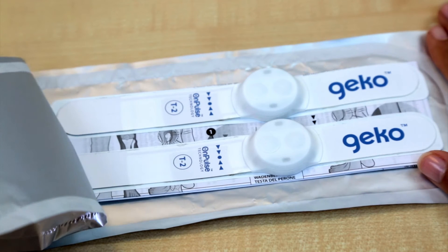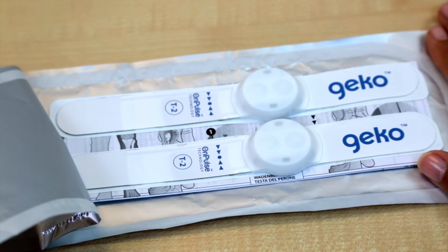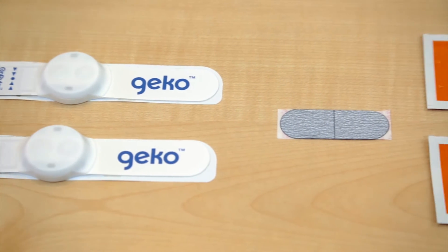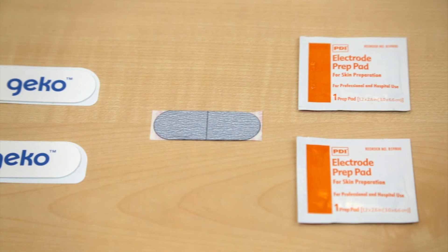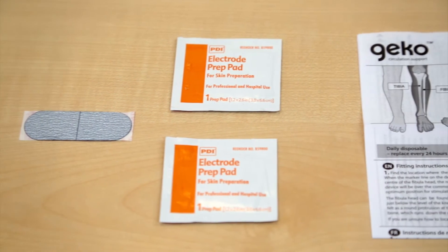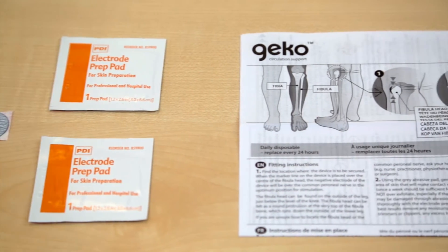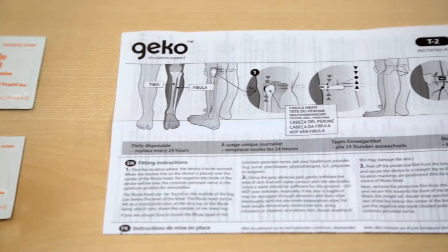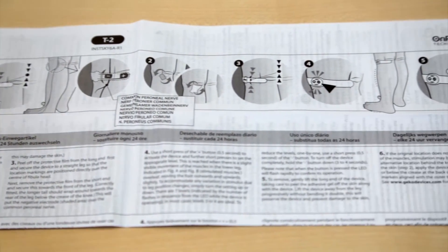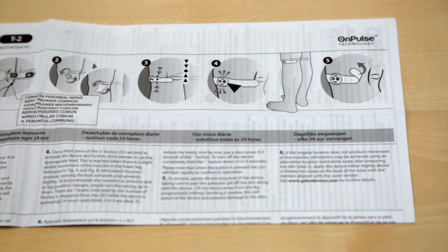To open the pack, simply peel the two ends of the foil pouch apart. Inside you'll find two GECKO devices, one grey abrasive skin preparation pad — the pad is in two parts so that a clean one is available for each leg — two skin preparation wipes for cleaning the skin, and one instruction leaflet. Read the instruction leaflet carefully to familiarise yourself with the warnings and precautions, and only use the devices as instructed.